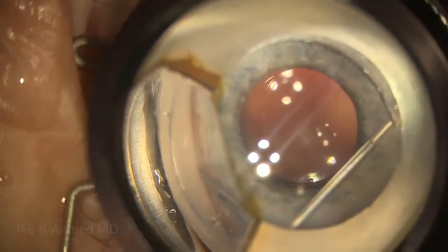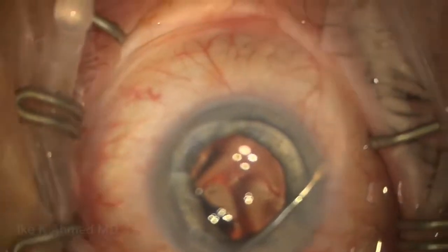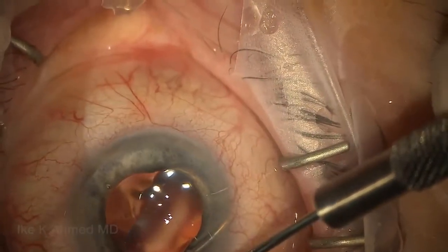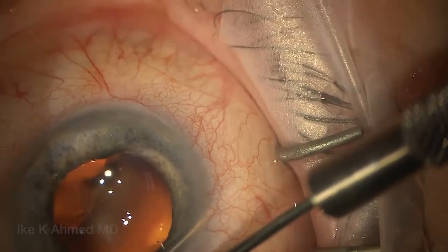Here I want to place the needle just anterior to the trabecular meshwork. This avoids reflux bleeding from the canal should we enter it — going only anteriorly helps to avoid that. We then use a Vero hook for counter-traction, pushing forward, trying to aim for a long track. We can always end up going shorter if we need to, but it's better to go long at first.